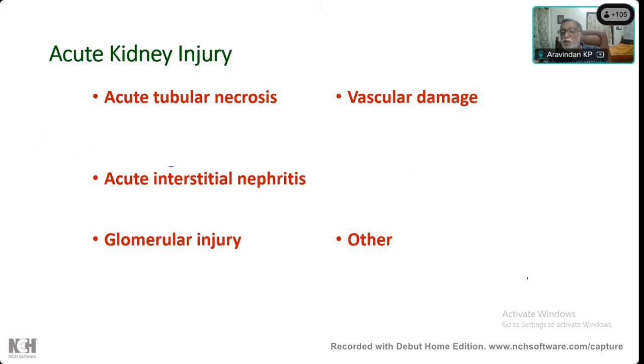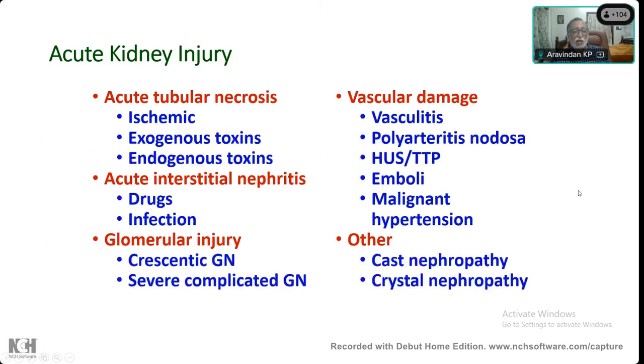Glomerular injury, some kinds of RPGN may have this kind of picture. Again, both have suddenly increasing creatinine. So it could be glomerular injury. It could be a vascular type of injury. So these are the different ones, and for each of these there are different causes, like vascular damage can have multiple causes. Cast nephropathy, crystal nephropathy, then drugs are one common cause of acute interstitial nephritis. So all these different causes could be there. So the first step is to look at the morphology when you have a kidney biopsy.